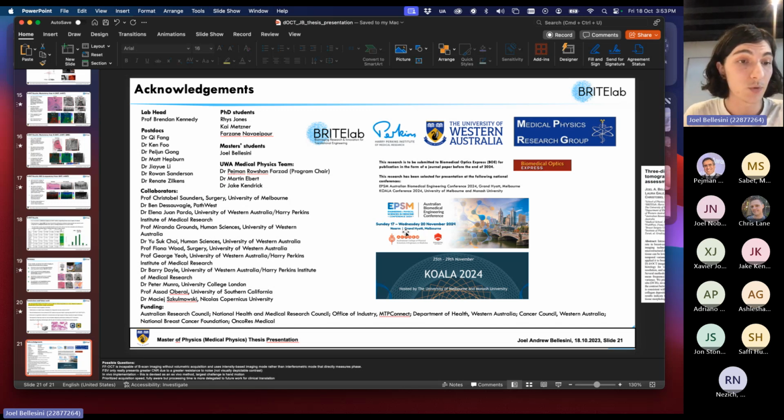One thing which we didn't do was compare compressed versus uncompressed dynamic OCT. That's something which maybe future work could look into. But my instinct tells me that in the uncompressed case, you've also got the fact that tissue, because tissue is quite fluid and non-solid, tends to warp or sink throughout the process of imaging over our acquisition time, and this would also induce a constant low frequency motion.